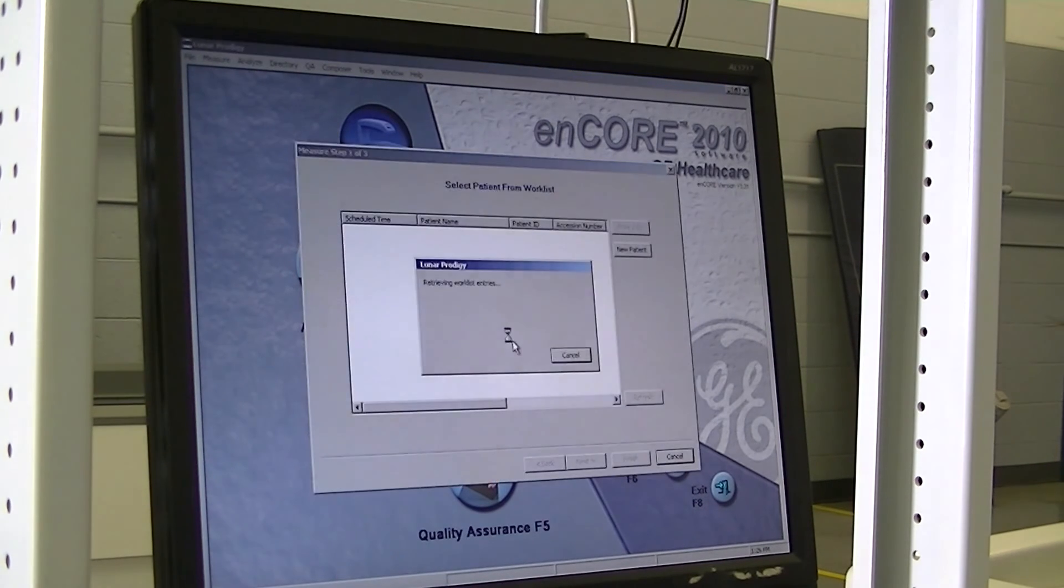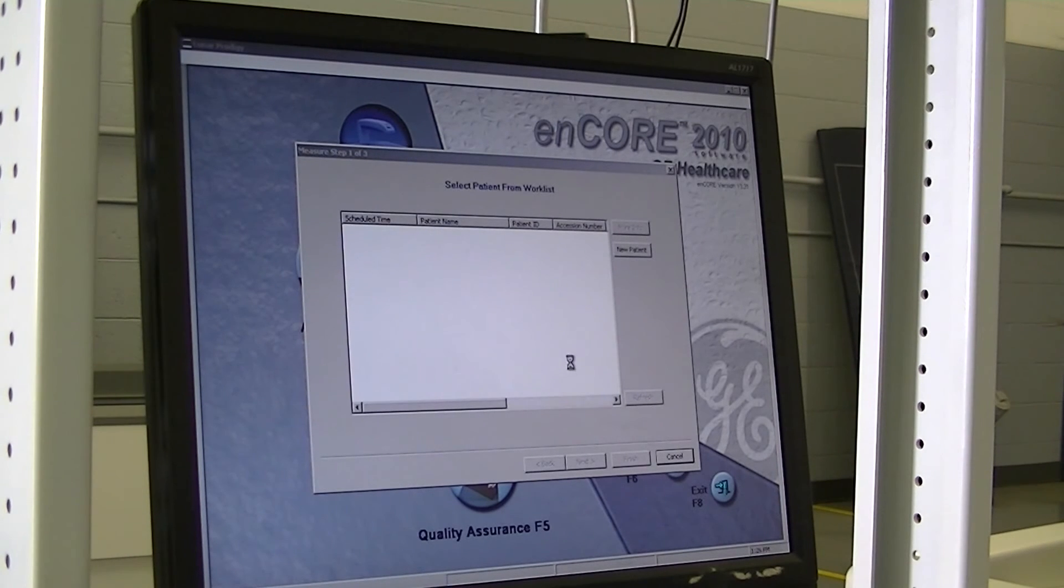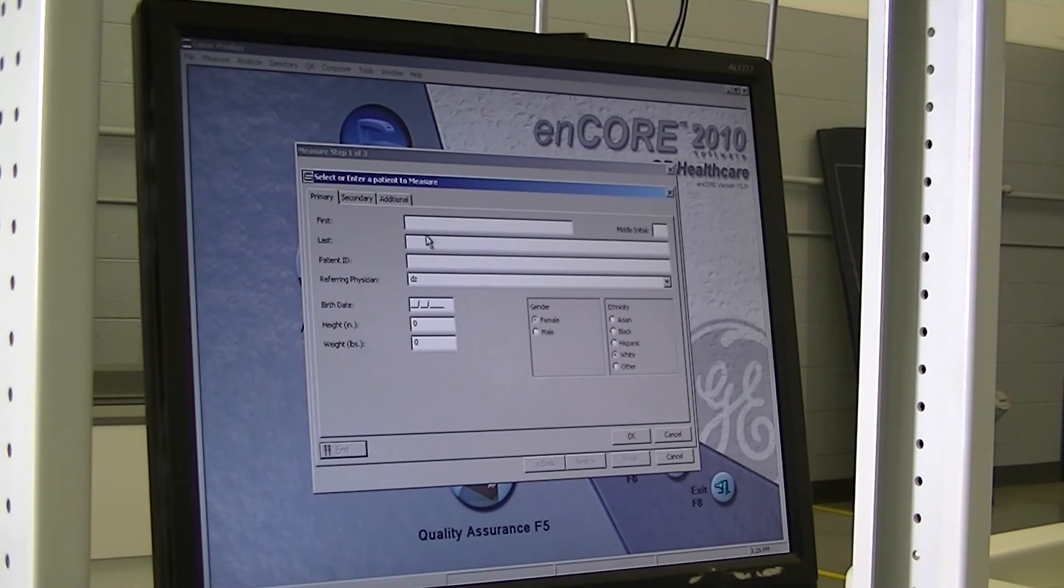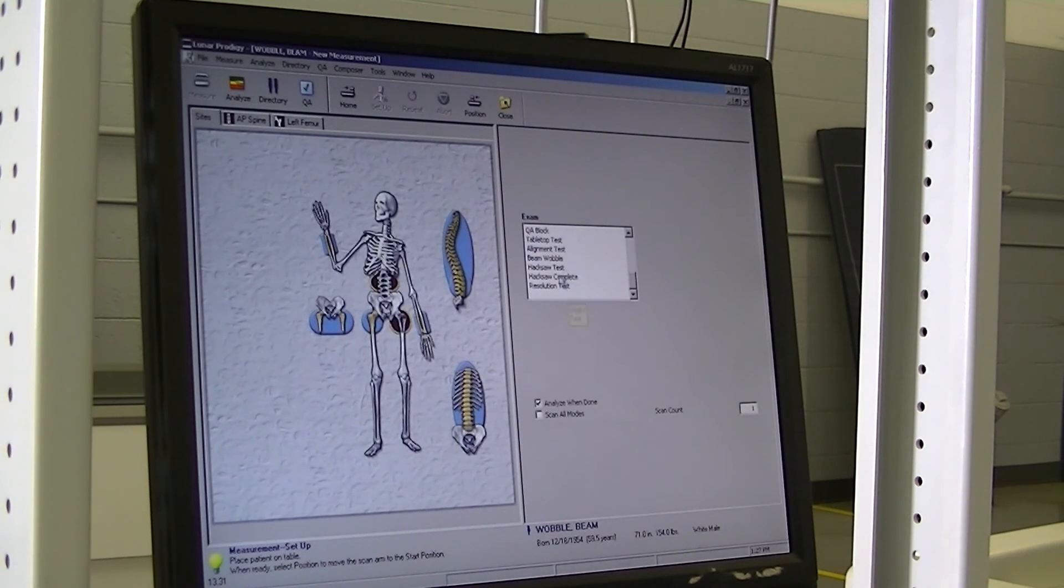New patient. New patient, first name: Beam. Last name: Wobble. Height: 71. Weight: 154. Male always must be selected. White. OK. Scroll all the way down on the right-hand page to Beam Wobble Test.